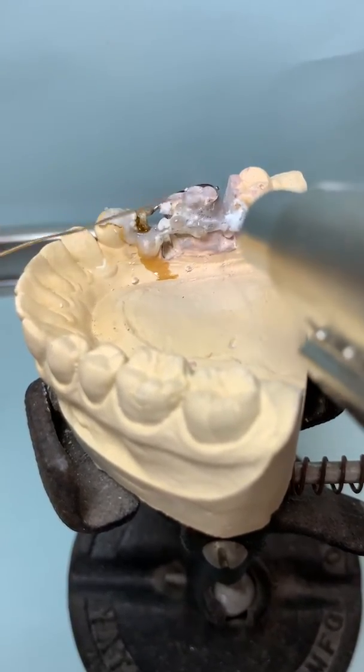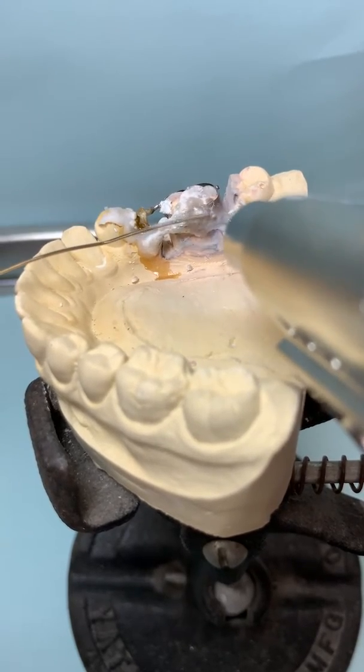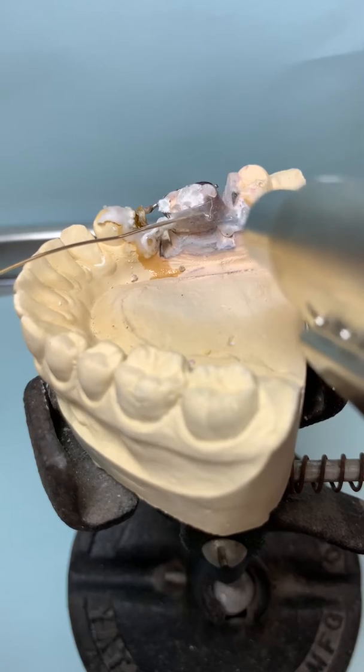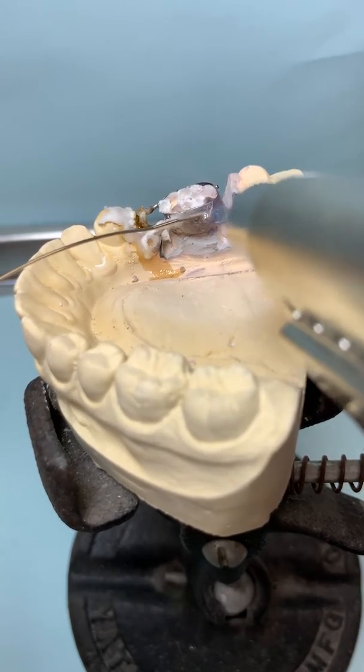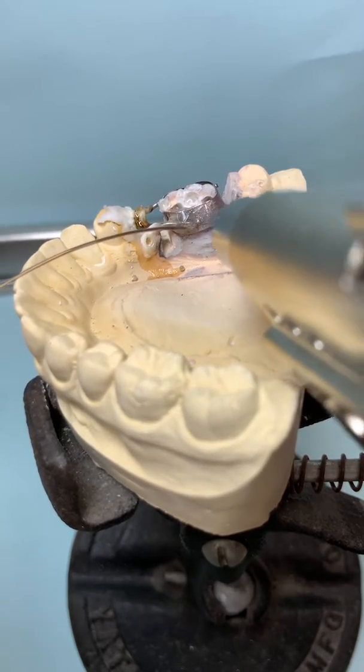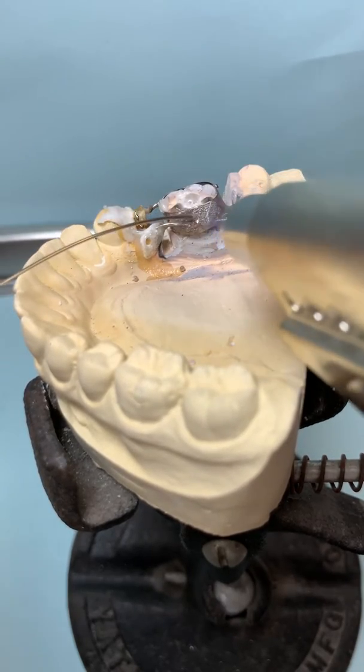Now that we're adding the solder, you want a constant heat. The solder is going to flow wherever there is heat, so you have to keep feeding it.